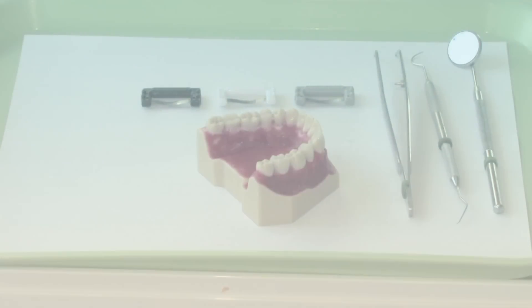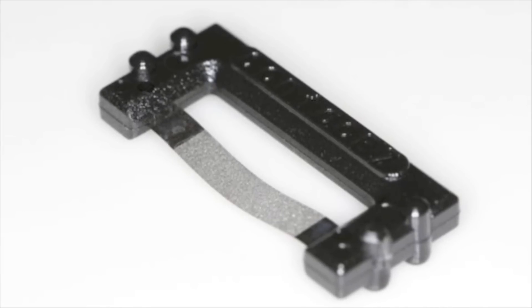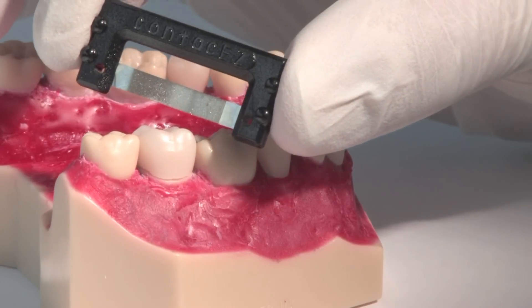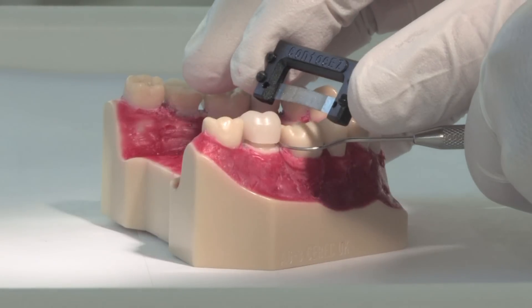The first step is to use the ContactEasy Diamond Dental Strip to achieve ideal proximal contact adjustment prior to cementation. The strip is ultra-thin, with an abrasive diamond powder on one surface. Use of this strip will provide you with consistent and objective proximal contact determination prior to crown cementation.